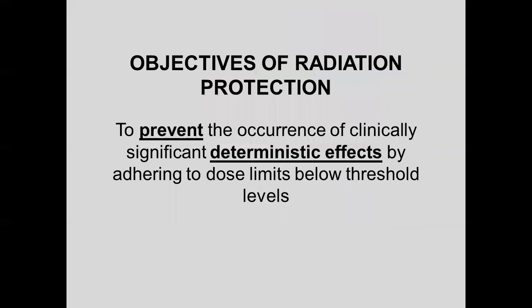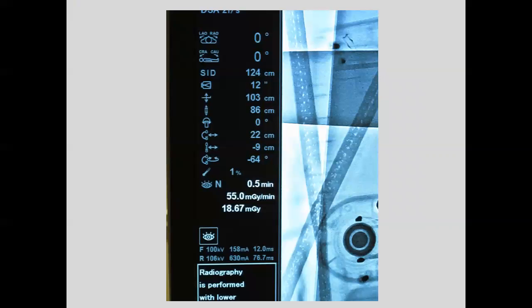And the other nice thing is when you're looking for peak skin dose, all right, now I want to say this, I think I have it later. They've also taken the body and gone into 9 different angles, caudal, cranial, frontal, so kind of around the world, divided the body up, and it will track how much radiation you had in each angle. So I think it's every 20 degrees. If you go 20 degrees caudal, it's going to look at just radiation in that angle. So it's going to do a better job of looking at what your peak skin dose is.